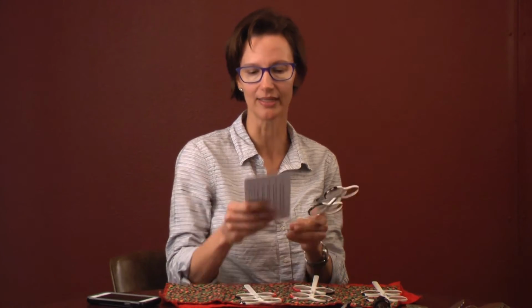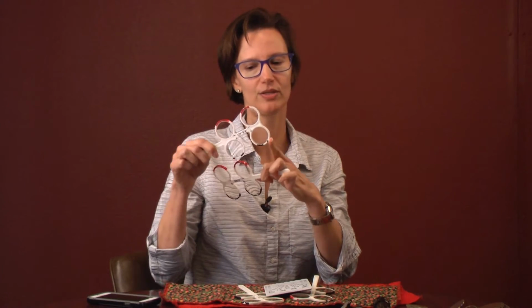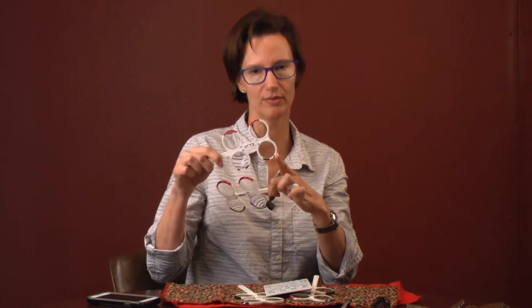So somebody sits down and they say, I can't see up close. I give them a card of some sort and then I start them off with the +2. If they have a really bad prescription, the +2 may not make it that much better, and so you'll see them pause and wonder, that didn't do much. So then if I don't get an immediate response with the 2, I go ahead and jump into the +3 on the black side.